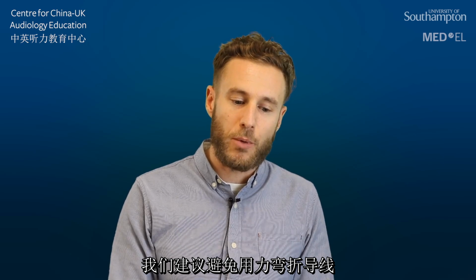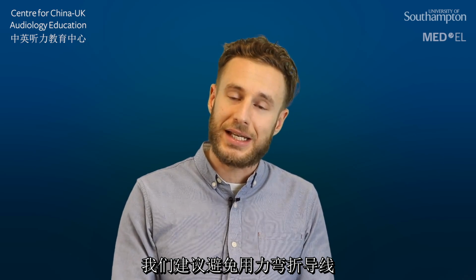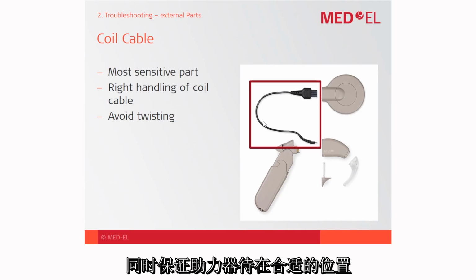So they should, if possible, avoid twisting the cable and make sure that the angle here is not too sharp when the coil is worn at the implant or over the implant location.